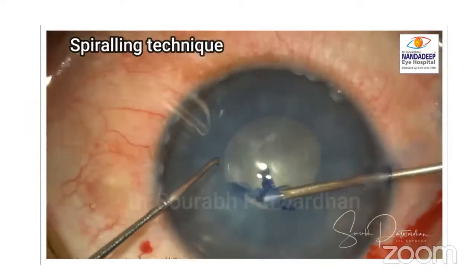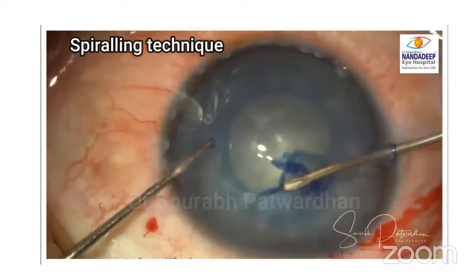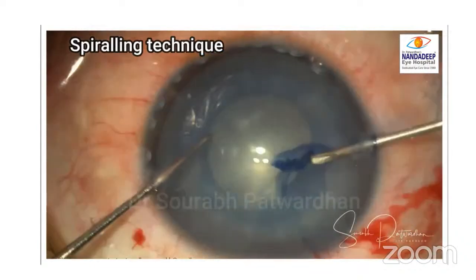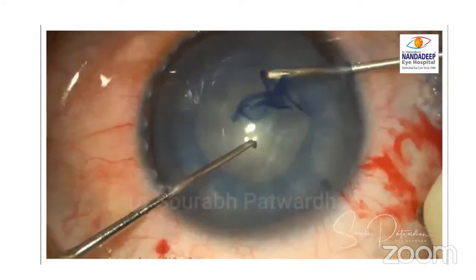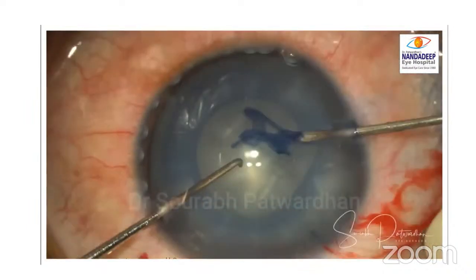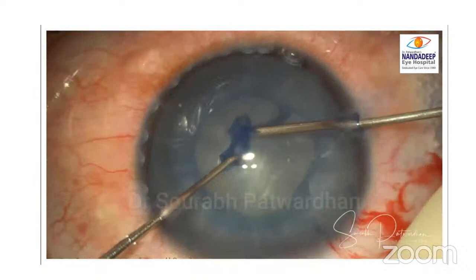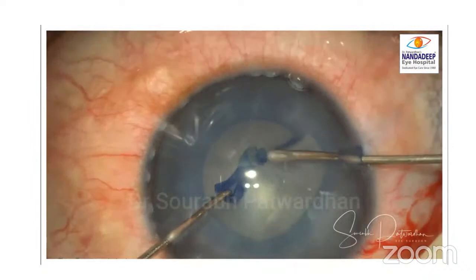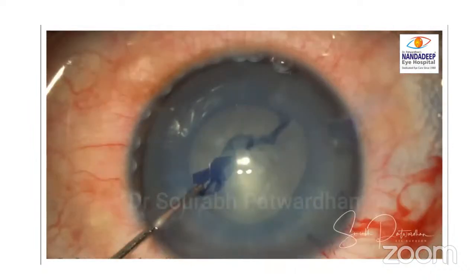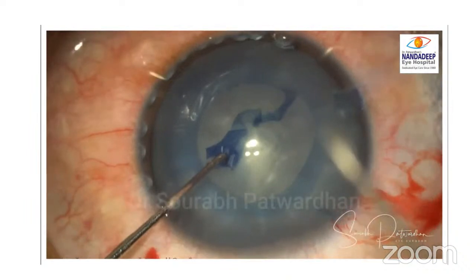Unlike intumescent cataract, where once you remove the intralenticular fluid and reduce the intralenticular pressure there is no further upthrust, in these cases the silicone oil, which is lighter than water, is continuously pushing the lens anteriorly. If there is a leakage from the antechamber anytime, it is going to cause outward movement of this capsular edge. I have seen surgeons trying to do it, and the tear just goes out radially without giving any time for the surgeon to react.